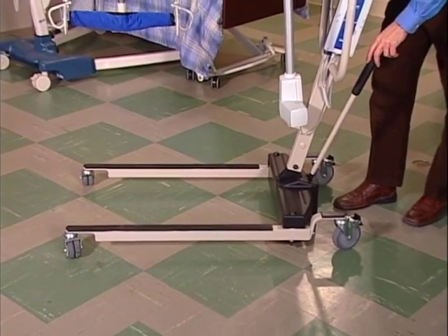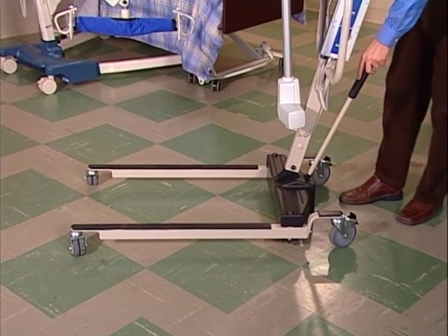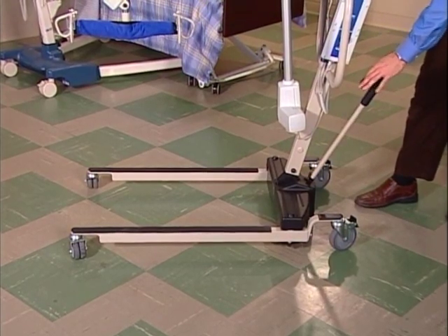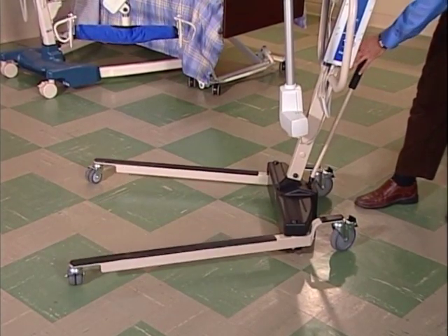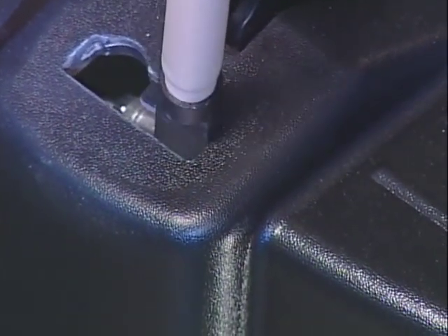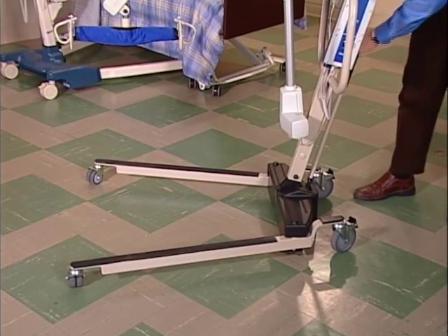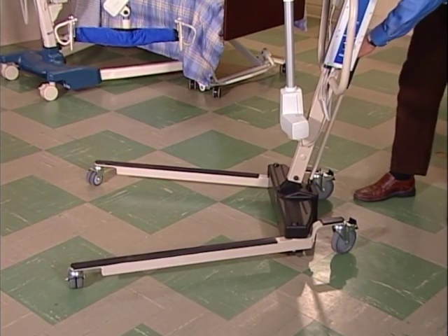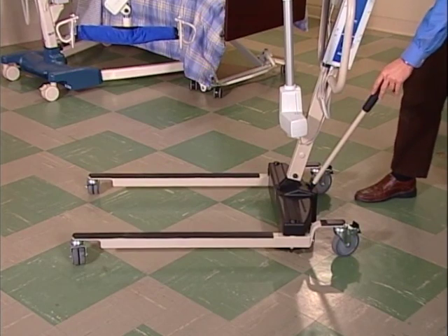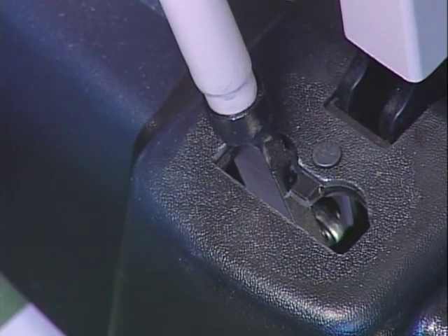It's pretty simple. To open the legs, grab the shifter handle with one hand and the steering handle with the other hand. Pull back on the shifter handle and move the handle to the right — the legs will open. Make sure that the handle drops into this slot to lock the legs into place. To close the legs, just reverse the process. Grab the shifter handle with one hand and the steering handle with the other. Pull back and move the shifter handle to the left and the legs will close. Make sure that the handle drops into this slot to lock the legs into place.